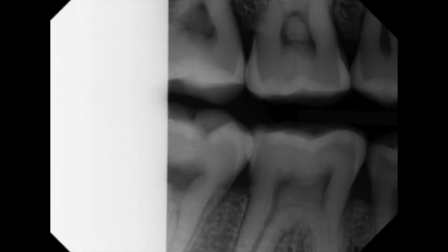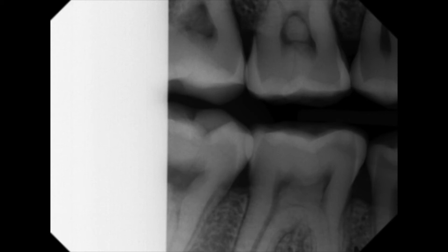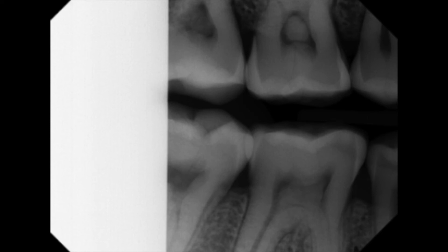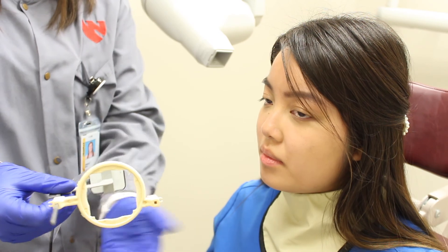Unfortunately, the sensor moved while trying to place it in the patient's mouth, and you can see that it produced a cone cut at the lateral aspect of the radiograph. It is important to note that if this kind of cone cut occurs, one should suspect that the sensor has moved in the mouth and not that the alignment of the PID was wrong. This can be suspected due to the fact that the PID was correctly centered around the ring and parallel with the indicator arm when the radiograph was taken.